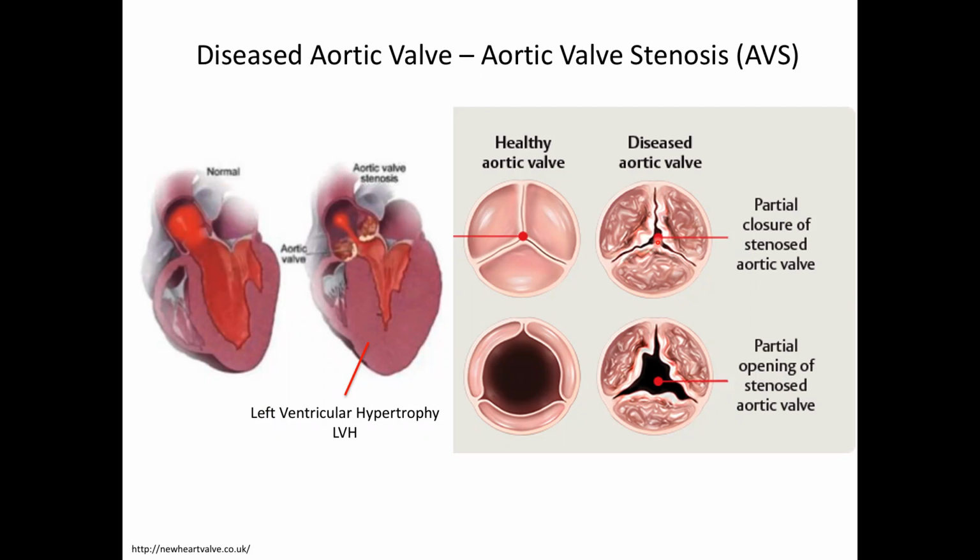So they crack the chest, expose the root of the aorta, cut this valve out, right? And then stick a new valve, a mechanical valve, in there, and you sew it down really well, and then put the aorta back on top, right? And you've got a new valve. This is just like night and day. It's fantastic, right? This is done a lot.